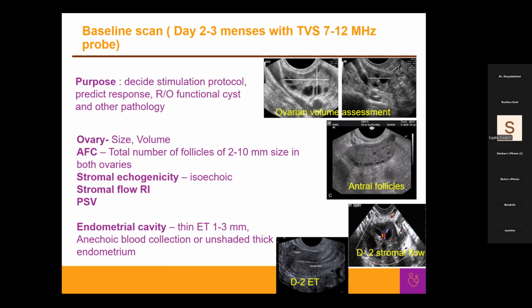See, monitoring basically gives you an opportunity to rectify the cycle. You can adjust the dose, you know the patient's biology, you can change the medicine, and you can trigger accordingly. The person who is doing the ultrasound may not give you the exact clinical picture. The clinician is the only one who gets the entire detail of the cycle, so your interpretation of the ultrasound could be very different from the radiologist's interpretation.